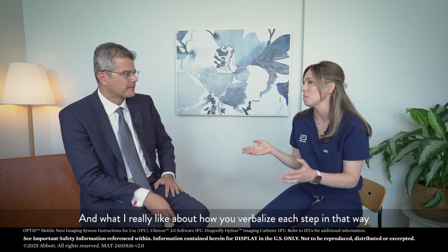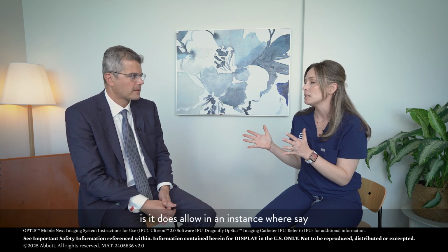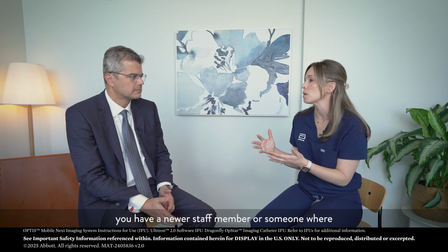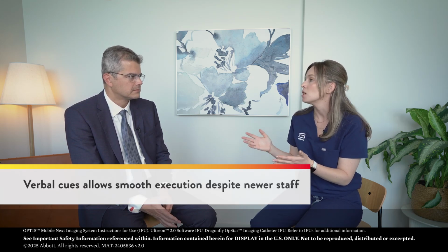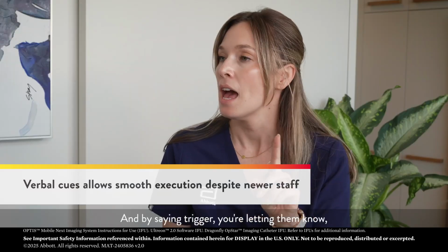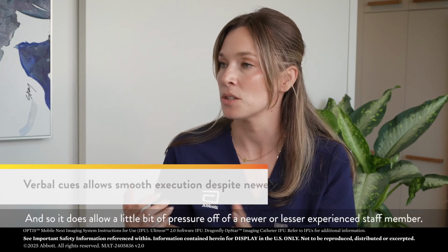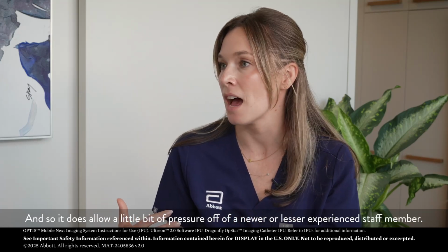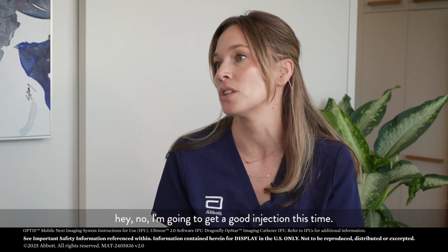Right. What I really like about how you verbalize each step in that way is it allows, in an instance where you have a newer staff member or someone we're not as confident in their ability to inject, you as the operator, knowing what needs to be done, can step in and be the injector. And by saying trigger, you're letting them know, hey, you just need to press this button when I say it. It takes a little bit of pressure off a newer or less experienced staff member, and it gives you more control as the operator to know, hey, I'm going to get a good injection this time.